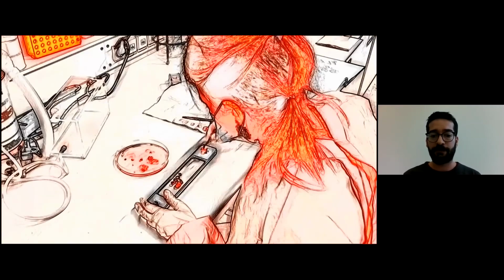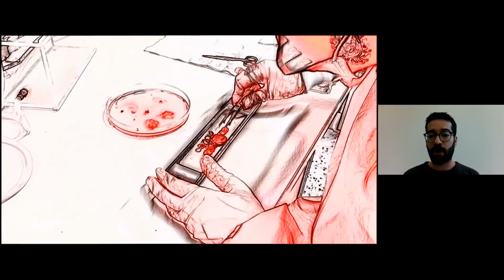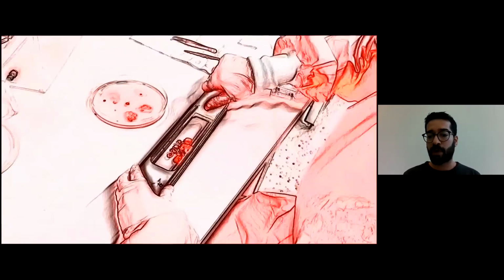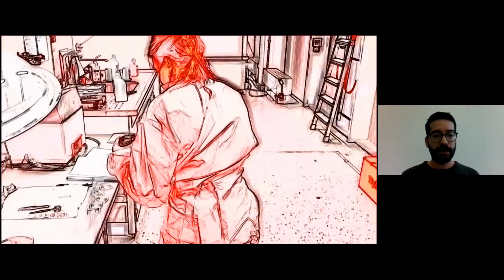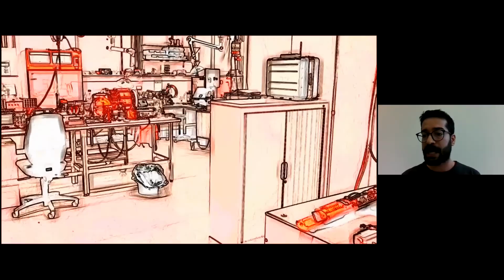Then we continue with ex vivo imaging. After 48 hours, we take the mouse, sacrifice it, and collect the organs, and we prepare them for ex vivo imaging. The reason we do that is that we want to corroborate our in vivo imaging data with ex vivo imaging. And you see again, we are preparing everything and we are ready to scan.